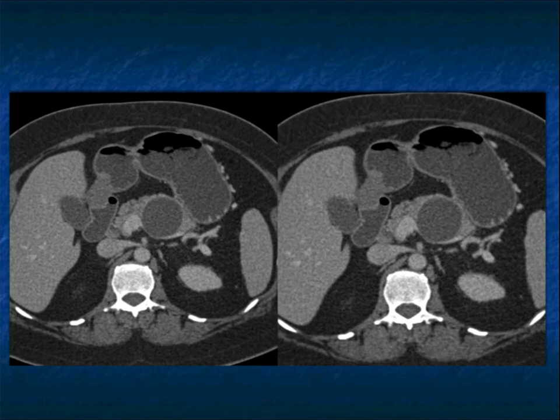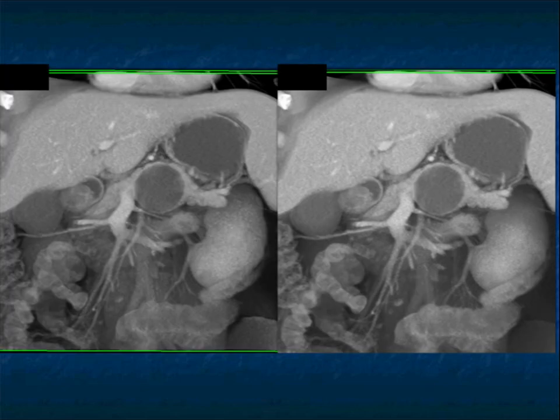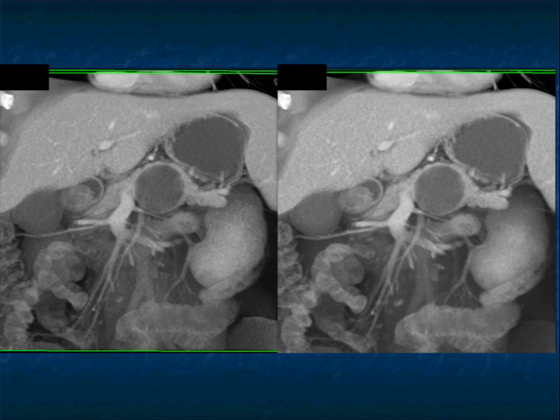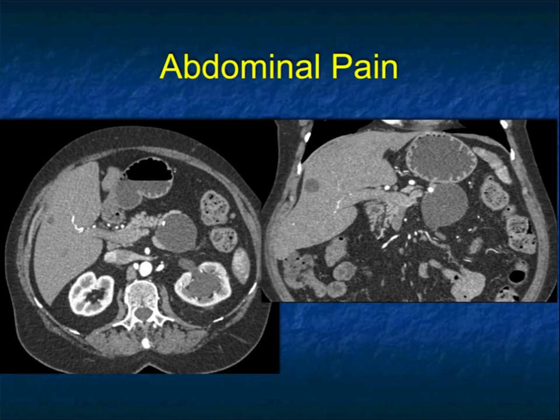Think about the positive findings as well as some of the negative findings as I go through the images. I am showing you a lot of images per case because I really want you to appreciate how the lesion looks in different perspectives — from axial to coronal, to volume rendering, and also to cinematic rendering. Many times, the 3D imaging will help you in determining specifically what the lesion is.